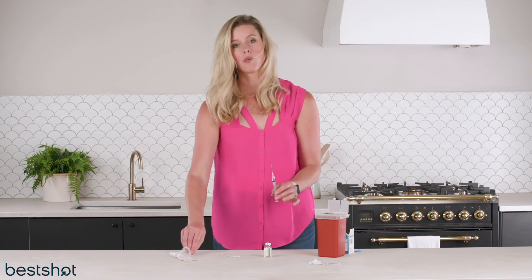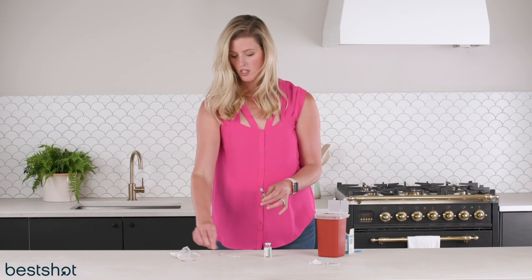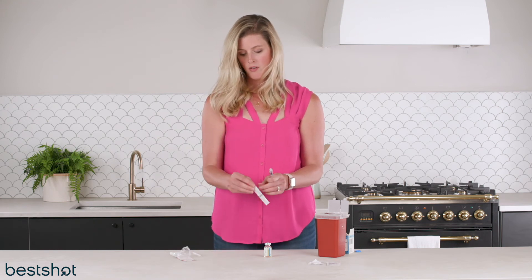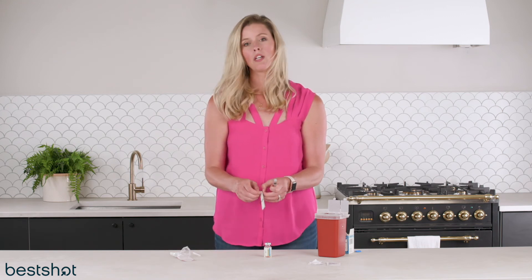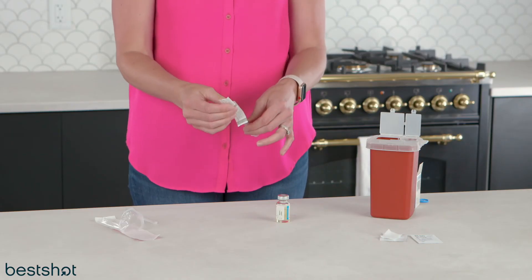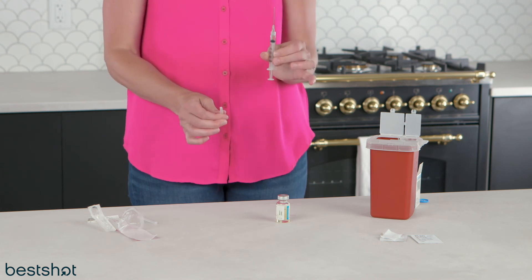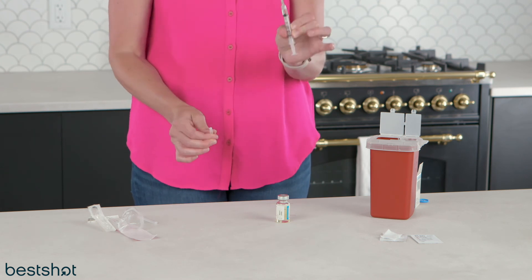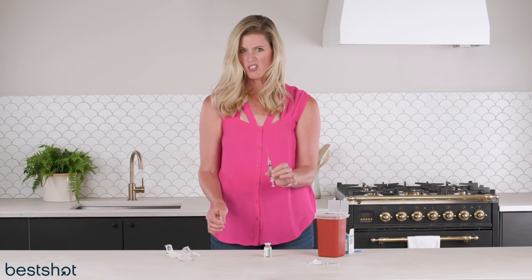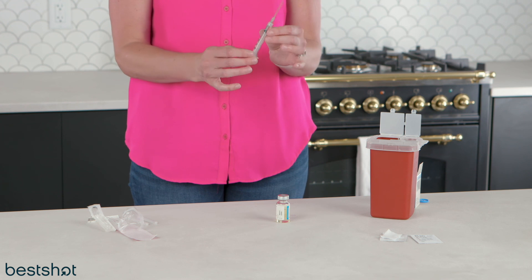Now I'm going to switch needles to the injection needle — get this 18 gauge out of here. Now remember when you were doing your 27 gauge half inch injections and you were scared of those little baby needles? Now we get to use the 22 gauge one and a half inch. This can vary, but basically this is the needle you're gonna use, and this is gonna go into you.